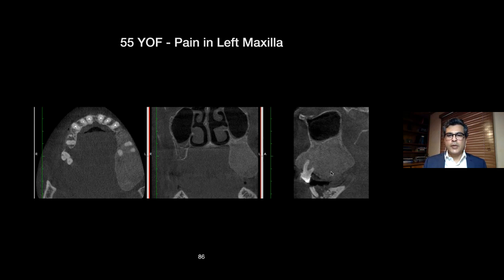So it was determined that for this patient, the imaging characteristics are pathognomonic of fibrous dysplasia and not of ossifying fibroma. It was hard because ossifying fibromas are usually said to have this thin radiolucent periphery versus fibrous dysplasia, but that cannot be seen in other parts. So of course we are still going to be following up on this patient, but it was diagnosed as fibrous dysplasia.